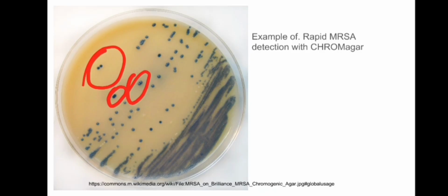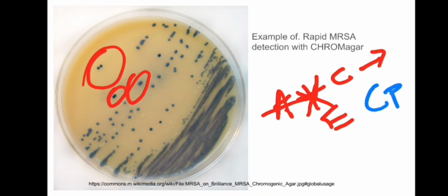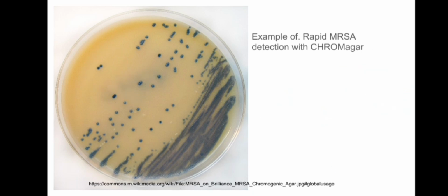So you have an antibiotic, which is hooked up with a chromogen. So in the presence of the enzyme, in case of MRSA, it will cleave this antibiotic, releasing this chromophore, which gives you a blue color precipitate that is shown here, right? That is the mechanism going on, which you guys already know, and I'm just keeping the audience broad.